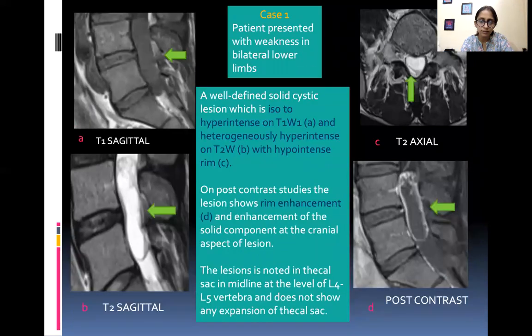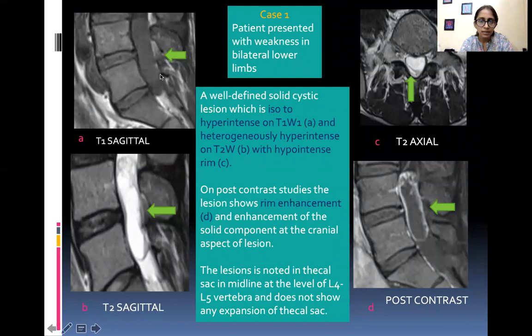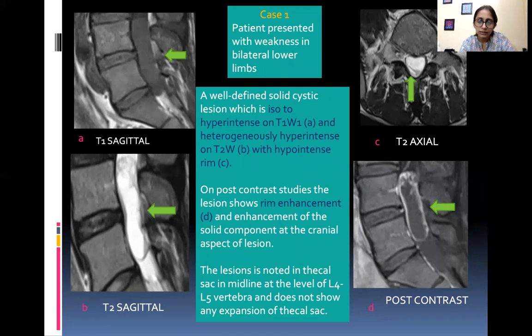Presenting a case of ependymoma: the patient presented with weakness in bilateral lower limbs. A well-defined solid cystic lesion, iso-to-hyper intense on T1-weighted images and heterogeneously hyper intense on T2 with a hypo intense rim, shows rim enhancement and enhancement of the solid component at the cranial aspect on post-contrast studies. The lesion is noted in the thecal sac in midline at the level of L4-L5 vertebra and does not show any expansion of the thecal sac.